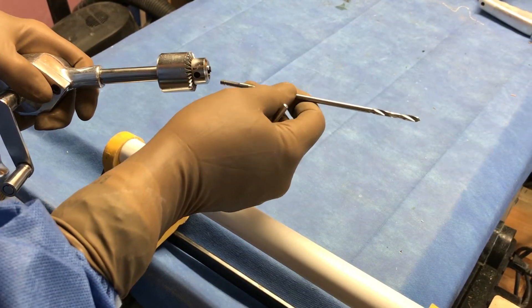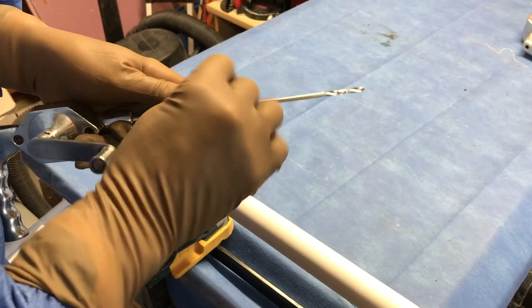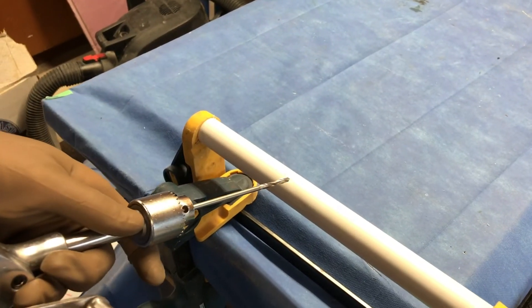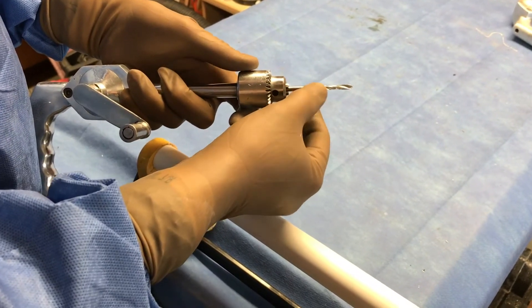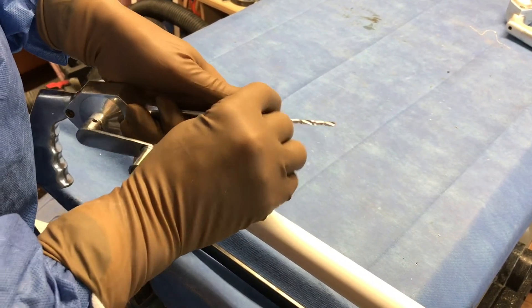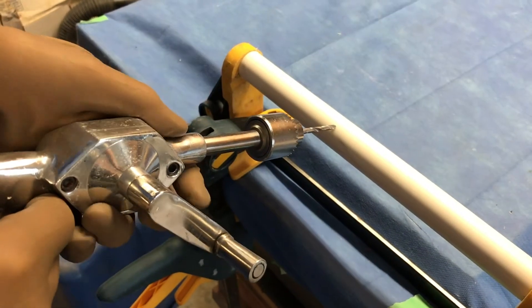Technical skill number one: setting the drill bit. When you put the drill bit in, if it's set very long, it can become very cumbersome to drill with when getting the orientation. So when you set the drill bit, set it at a good working length, making sure you can get through the tissues — in this case about five centimeters or two inches. That will make a nice working length so that you can control the drill tip much more easily.